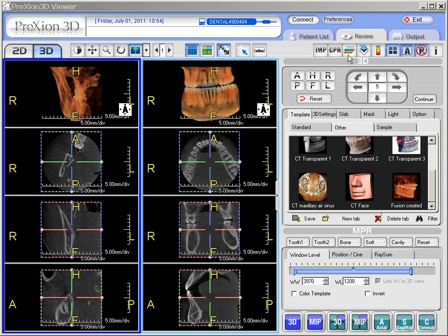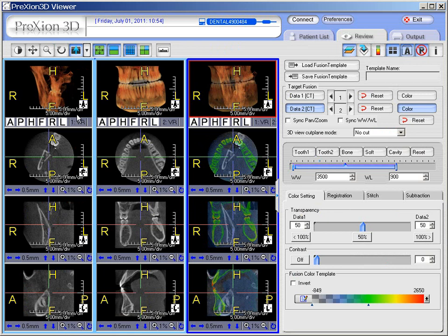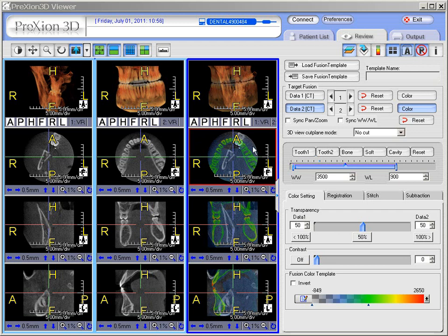The next step, we apply the fusion function. Here we have the fusion tab indicated by the little blue and gold tab right here. We click it and then we get our fusion of the two studies into a third vertical column where we can apply manipulations and adjustments. Notice in this third column, we have one of the data sets — in this case data set 2 because it's highlighted — that is going to be highlighted with the color, providing contrast against data set 1. You can quickly change that to data set 1 to have that colored as well; it's a personal preference.